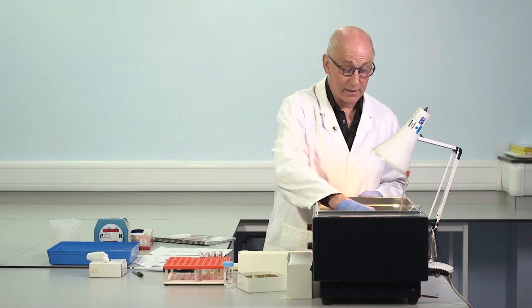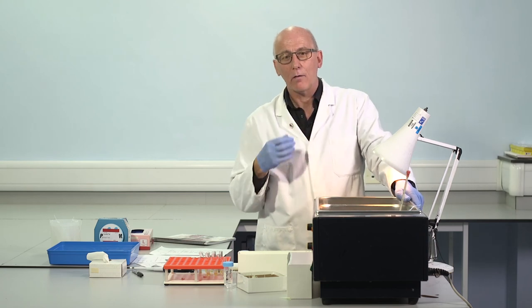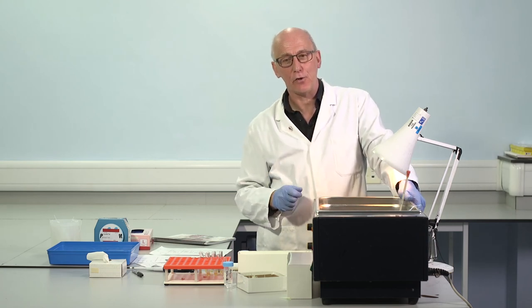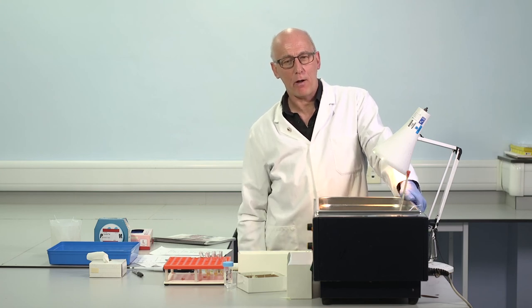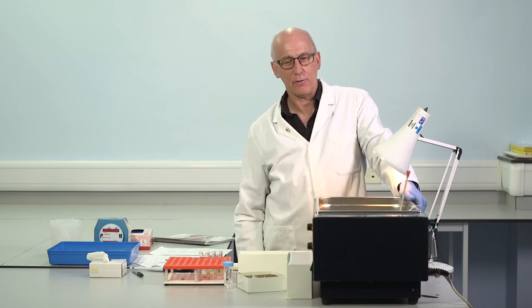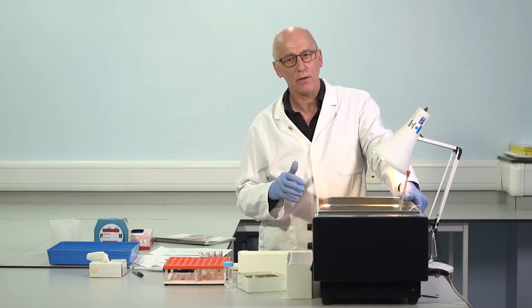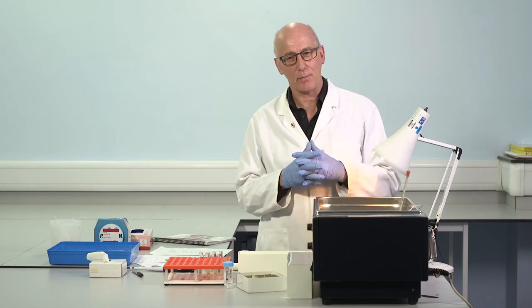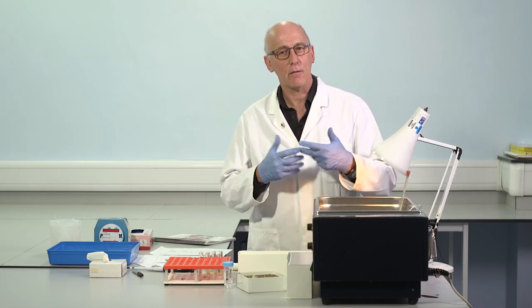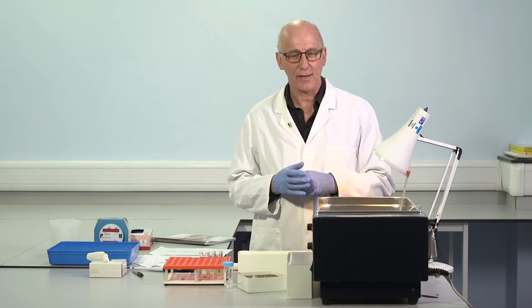The APTT is also particularly sensitive to the ratio of blood to anticoagulant in the tube, the filling of the tube. You know that the normal ratio is one part anticoagulant, nine parts blood. If we deviate from that, and particularly if we reduce the volume of blood, therefore the volume of plasma, and change the ratio of citrate to plasma, there are important dilution effects: citrate excess, false prolongation.